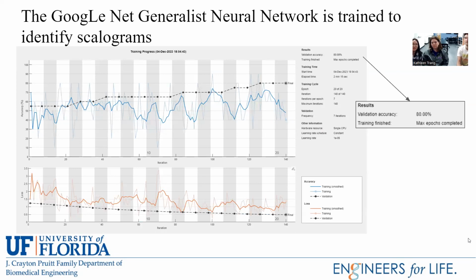Okay, so the first thing we did was obviously we trained the model. So this is kind of an overview of the training process. At the end of that process, we had a validation accuracy of 80%.